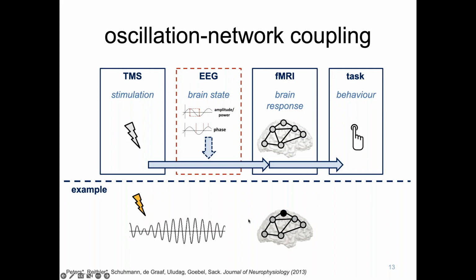And at the same time, following the same logic, if you apply TMS in the same subject to the same area with the same intensity, the same TMS pulse, but now it happens to be applied at a moment where the spontaneous alpha power in this area is low, maybe then, because now the gate is open, so to say, your TMS pulse is actually spreading through the entire network because it's now ready to be propagated from the cortical target to all the other connected regions. This is a hypothesis. This is something that you could speculate.